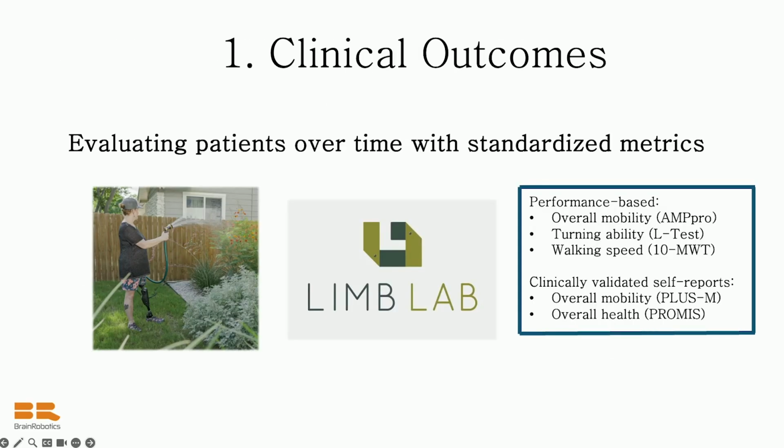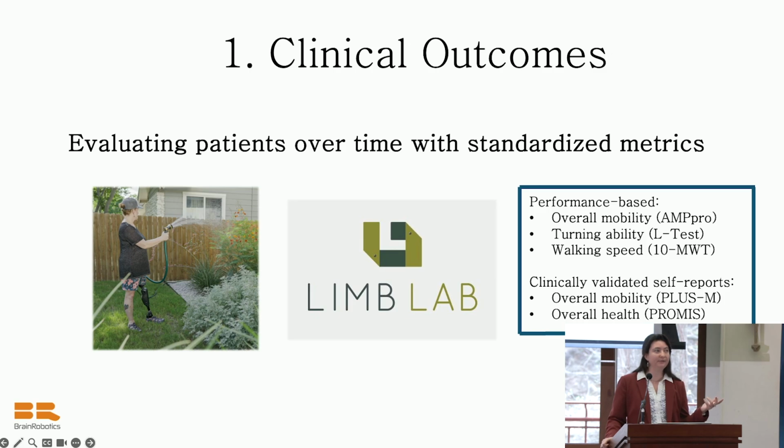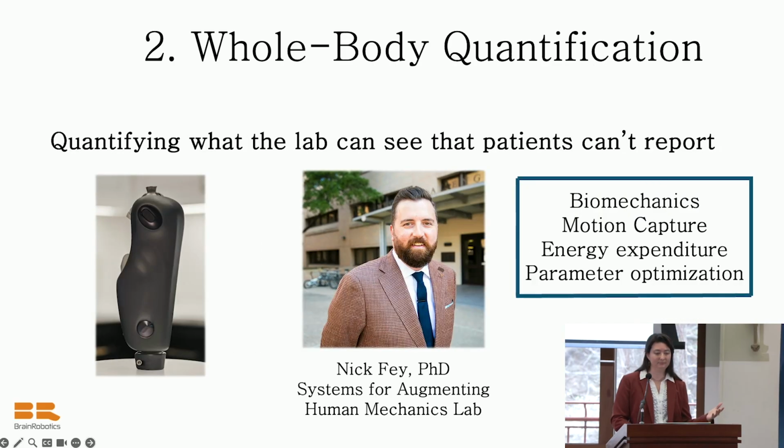The first track is built around standard outcome measures collected at multiple patient clinics. These are validated tools that the broader clinical community already uses and can trust, which matters for how our findings will be received and acted on. Data is collected at intake and updated quarterly, so we're building a longitudinal picture of how patients progress over time. This track keeps patient outcomes at the center of our research.